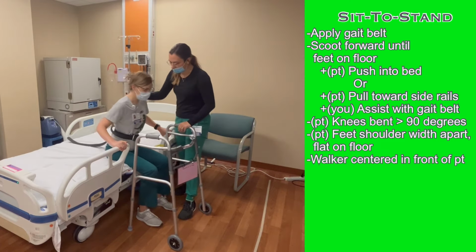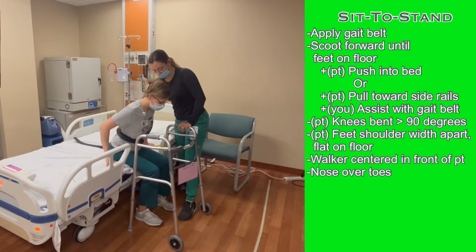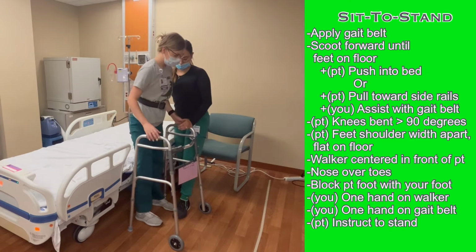Begin by having the patient lean forward into a nose-over-toes position. Then, put your foot directly in front of the patient's nearest foot, to prevent any sliding of their foot while they stand. With one hand, hold the walker in place to prevent it from potentially sliding or moving while the patient gains their balance. With the other hand, grasp the gait belt from behind the patient and instruct them to either push up from the bed or from the side rails.